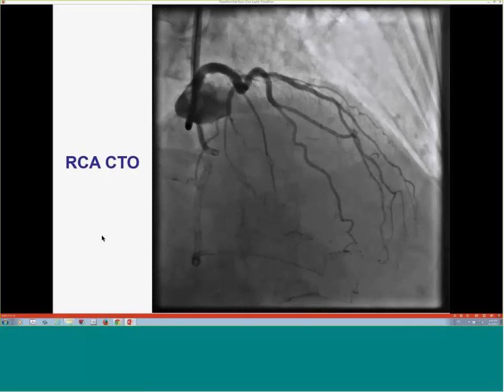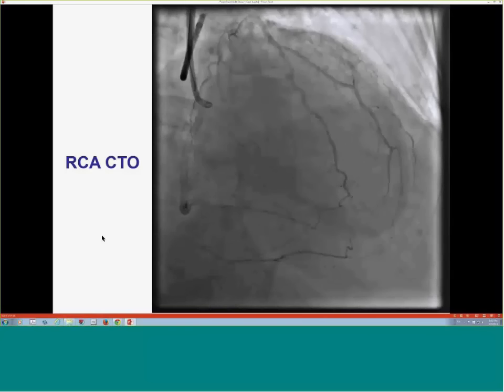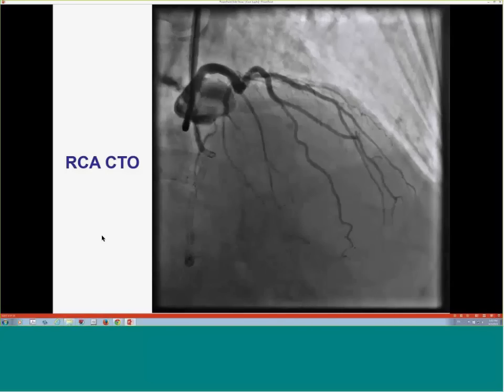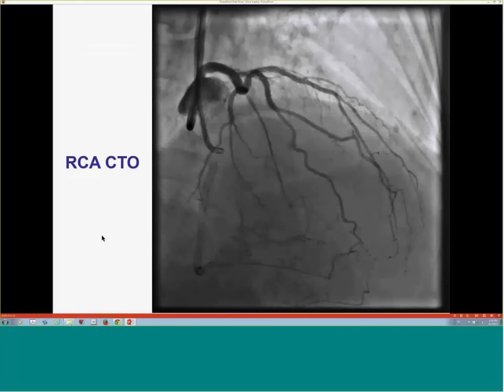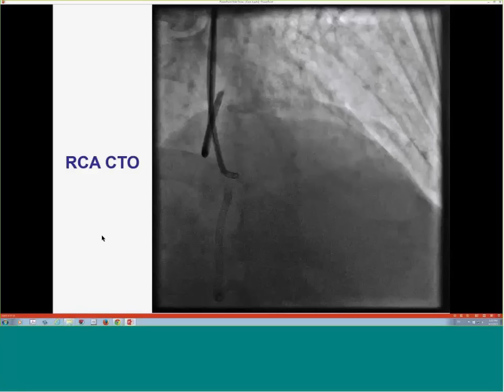Yeah, I don't see the cine runs on my end yet. It says it's preparing 99%. Oh, I see. Yeah, sometimes it just takes a while. It's loading up. Yeah, something is happening. We'll see. Yeah, there we go.